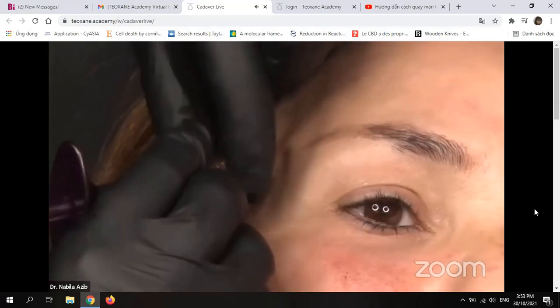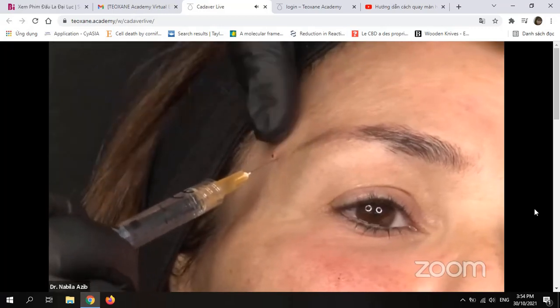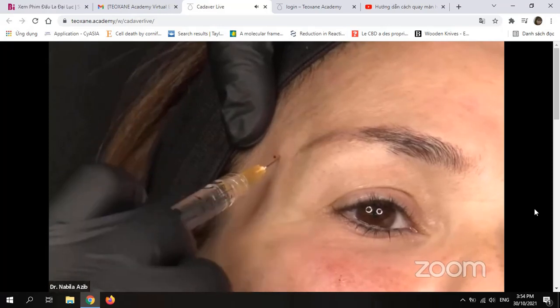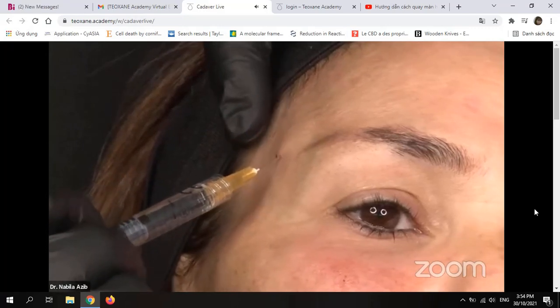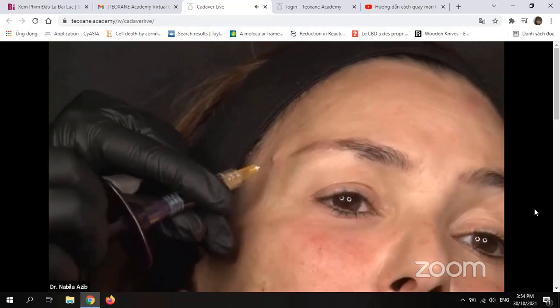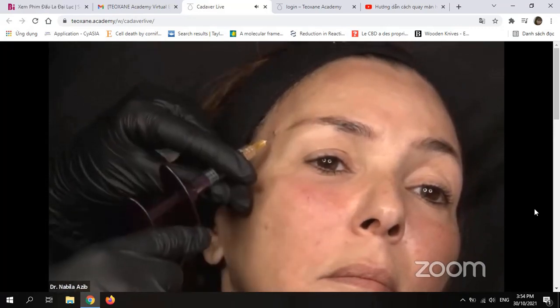Yes, Ludmila, I don't aspirate, regarding the literature, because you can have up to 33% false negatives first, and also when you aspirate, look, if I aspirate here, I need to use my other hand to aspirate. So that means that my needle has already moved. So maybe at the beginning I was not on a vessel, but when I moved, I was in the vessel.